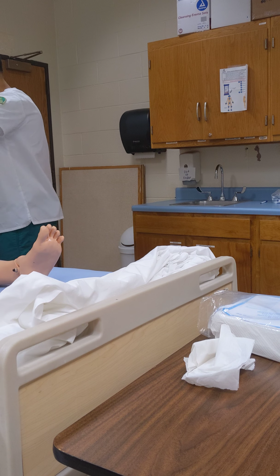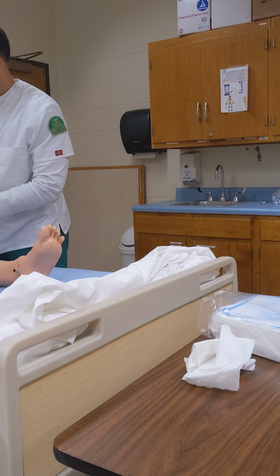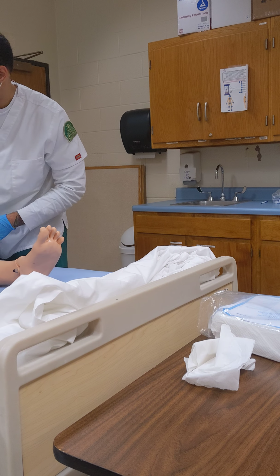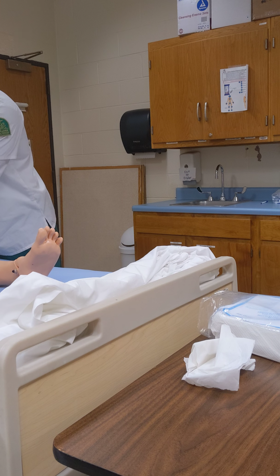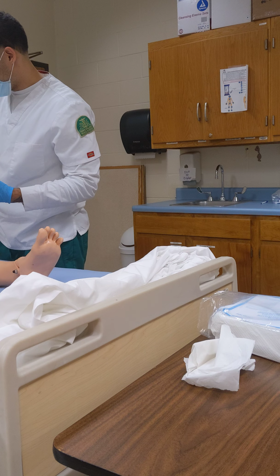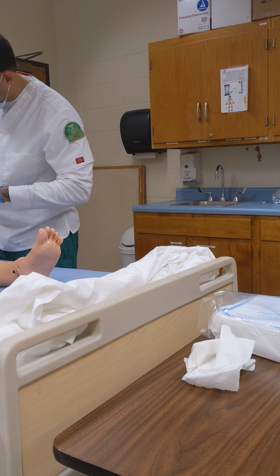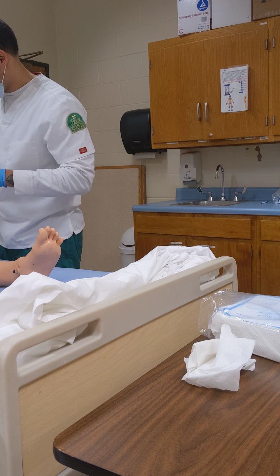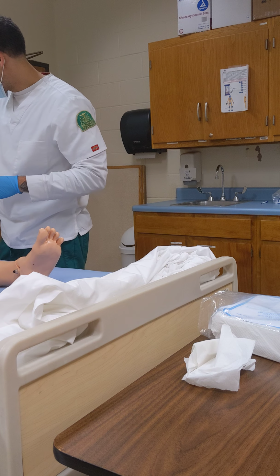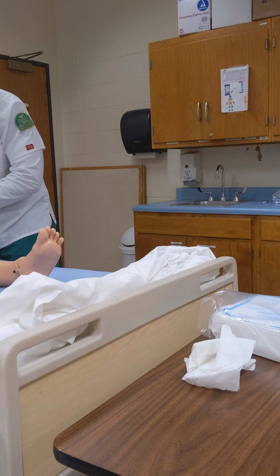We'll be placing the bath blanket on top of them, telling them why, for their privacy, and letting them know that I'm going to be exposing the vagina so that I can see if there's any discharge or any issues prior to starting, any redness, any discomfort, and there doesn't seem to be. So I'm going to leave this up.